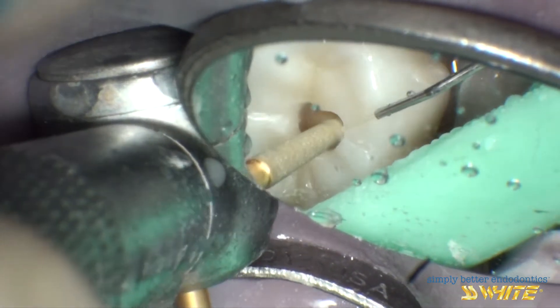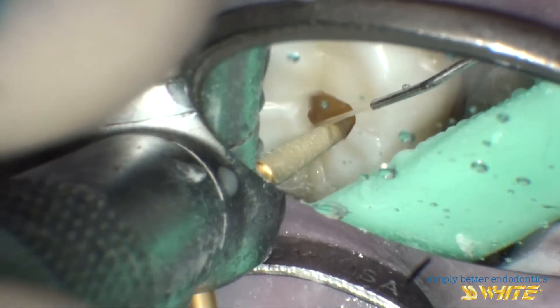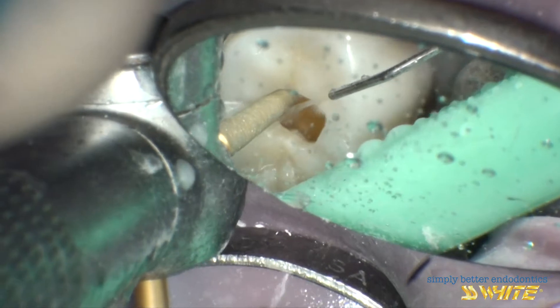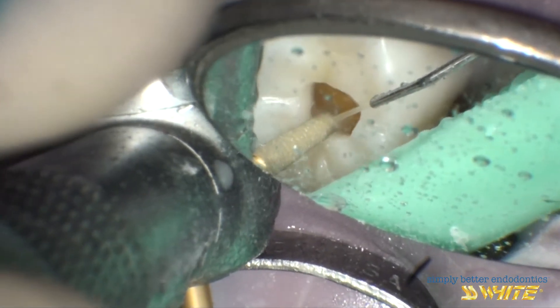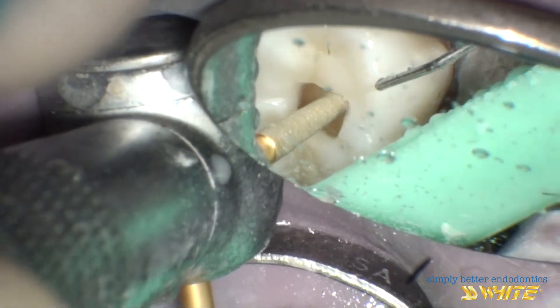This access prep will be a stepped access, which means that the opening in the crown material will be wider than the opening into the dentin and pulp chamber. Since widening the opening in the crown does not structurally compromise the crown, it can be opened wider to allow for better access and visibility.